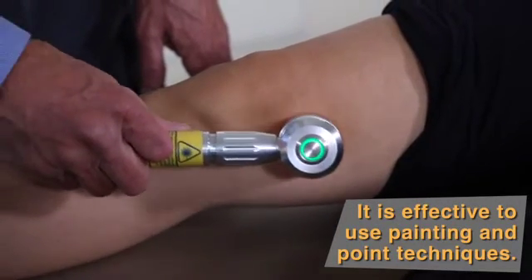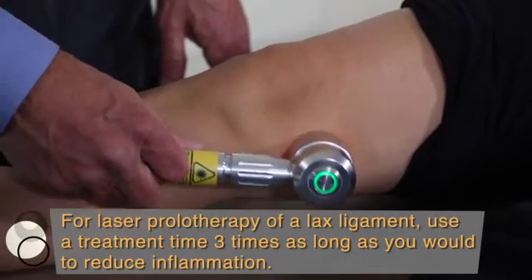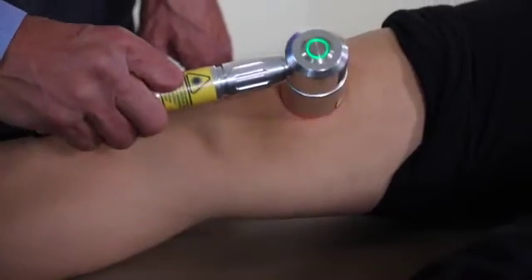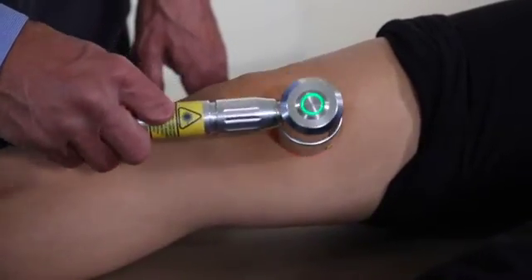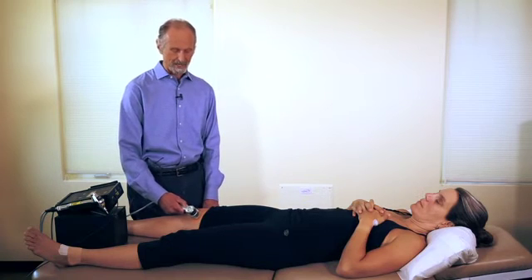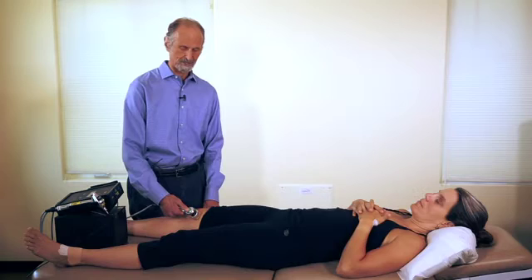Now, if you're going to do something like laser prolotherapy — where you want to increase the strength of the ligament and the ligament is lax — you would leave it on a spot for three times the amount of time you would use for reducing inflammation. So if I put it on this spot for 30 seconds, I might then put it on this spot for a minute and a half if the ligaments of the kneecap are hypermobile and overstretched.